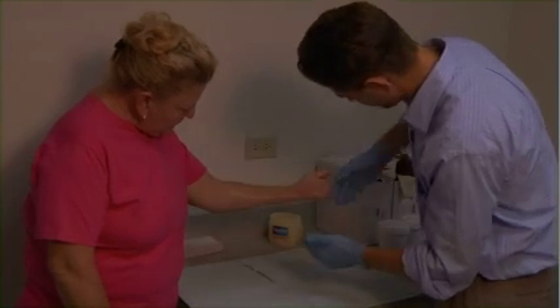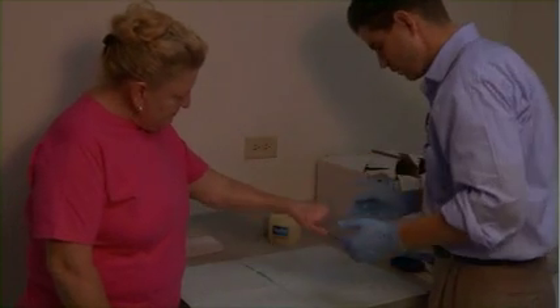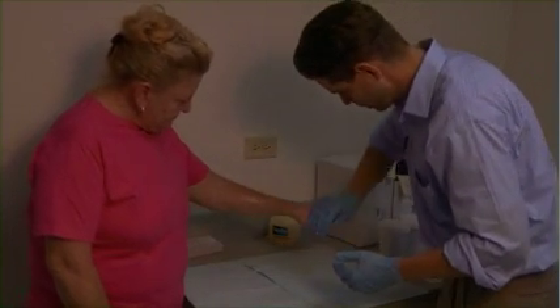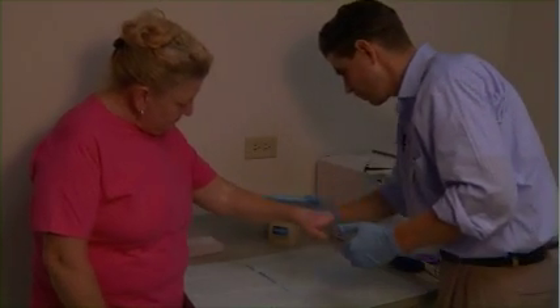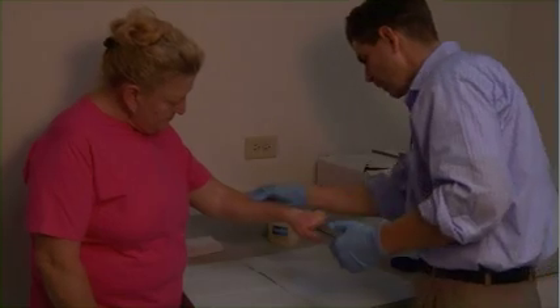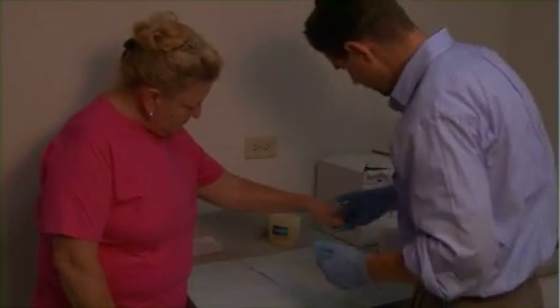You want me to flip it over? Yeah, you can. This will also keep — when we pull the mold off — it'll keep from pulling hair. Maybe not every hair, but.